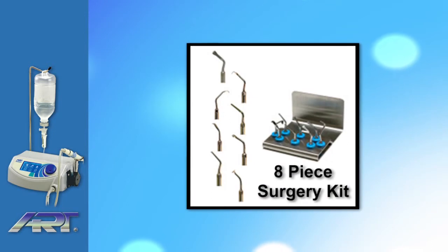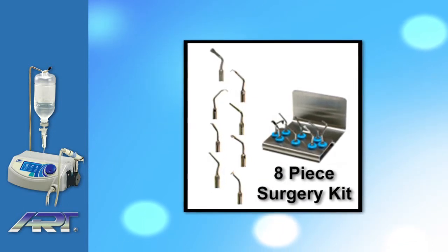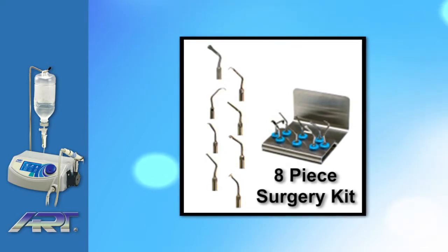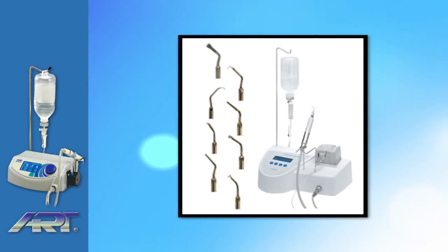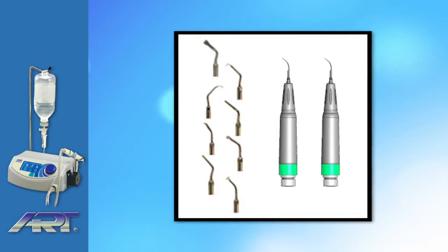The Ardiotomy Piezoart OP1 comes with an eight-piece basic bone surgery kit, and any additional or special tips are available upon request. Tips are made to be compatible with major brands like Metron's Piezo surgery system, among a few others. The kit also comes with two autoclavable handpieces.